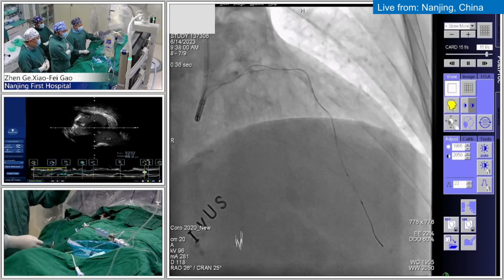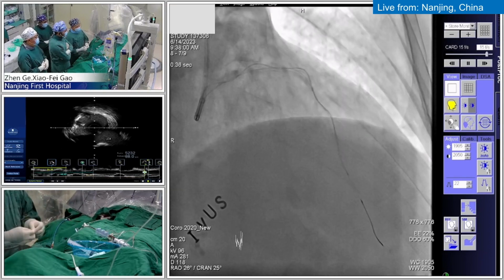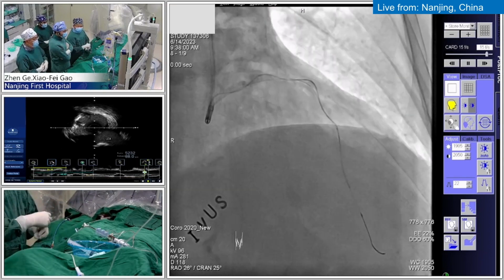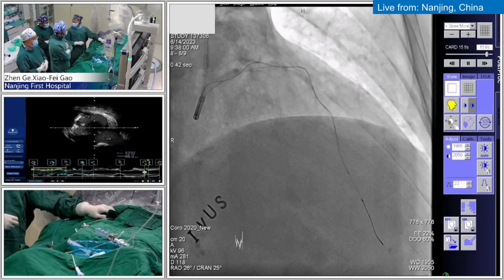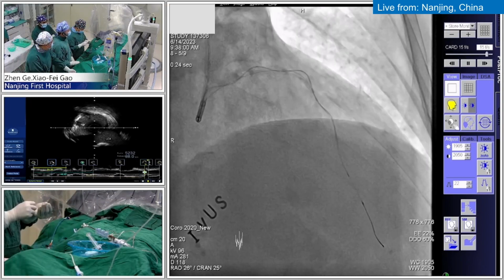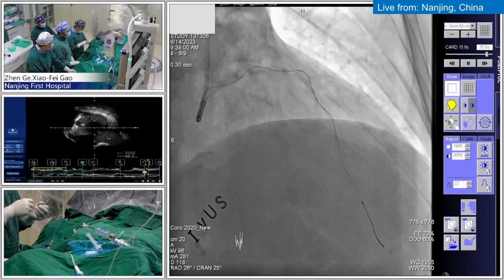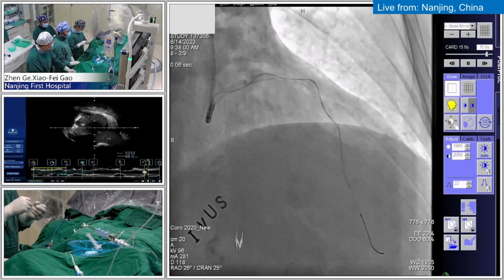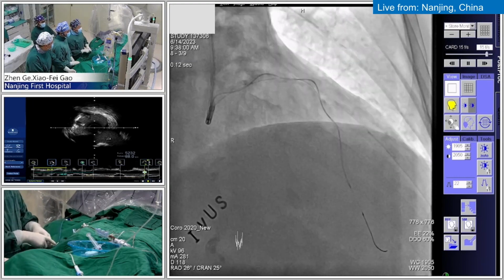Say this patient has distal left main disease, and because the ejection fraction is normal, I don't want to put in mechanical support, but I already punctured the femoral artery. Because the distal left main bifurcation, based on the definition criteria, is a simple bifurcation, and the circumflex is not a big vessel, I want to use provisional stenting for the distal left main.